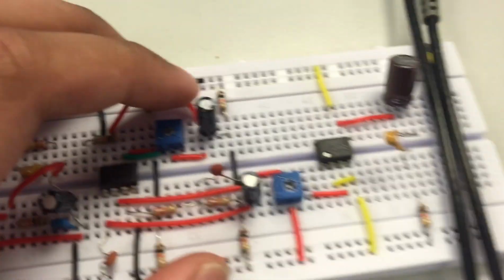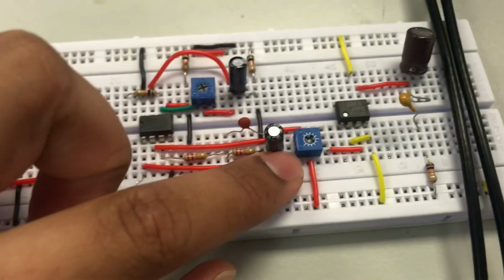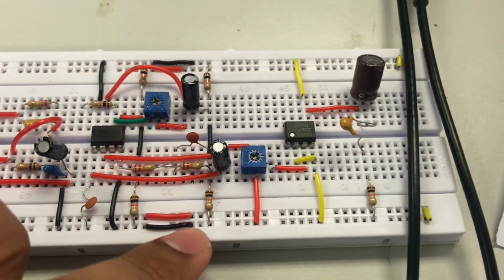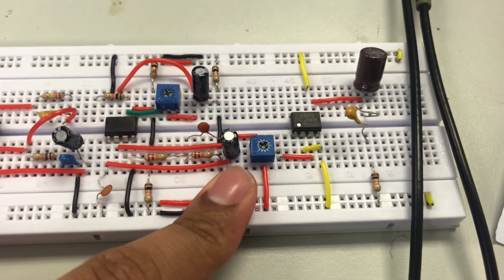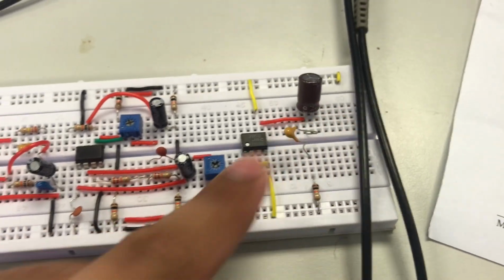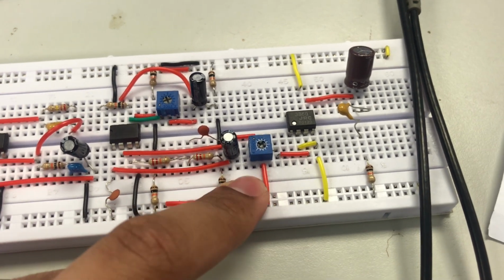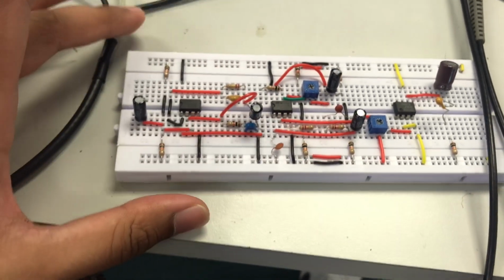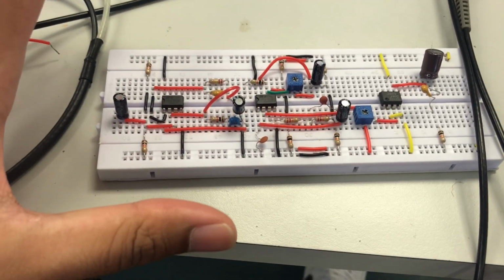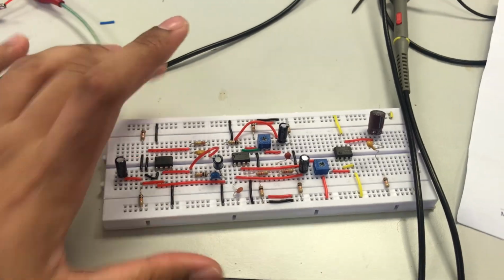TP4 will be here, and TP5 should be here. In this case, TP4 and TP5 will not have a solid graph because the graph is not readable. So I will explain the graphs on paper with a passband graph, with all the bandwidth and everything. So this is the basic outline on what I am going to do for the project and the patching, what I did for the patching and the project.